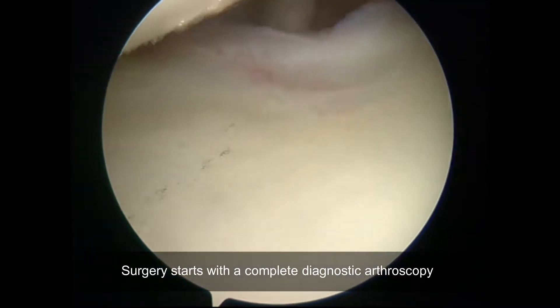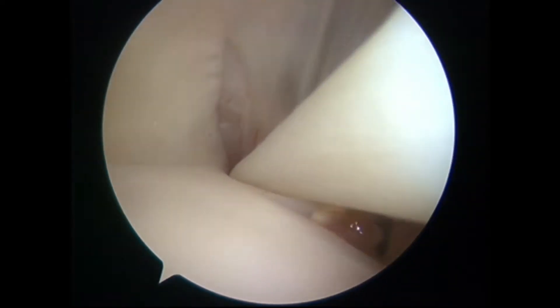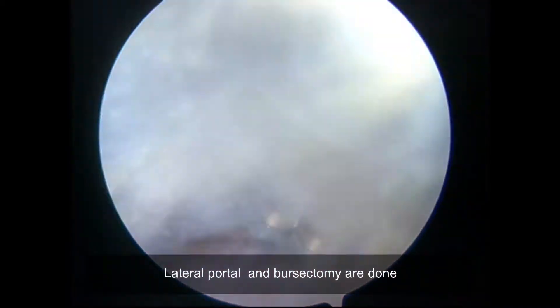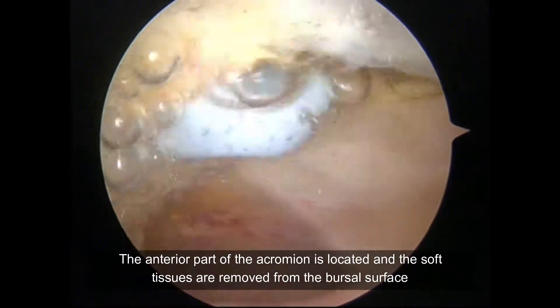Surgery starts with a complete diagnostic arthroscopy. The lateral portal and bursectomy are performed. The anterior part of the acromion is then located and the soft tissues are removed from the bursal surface.